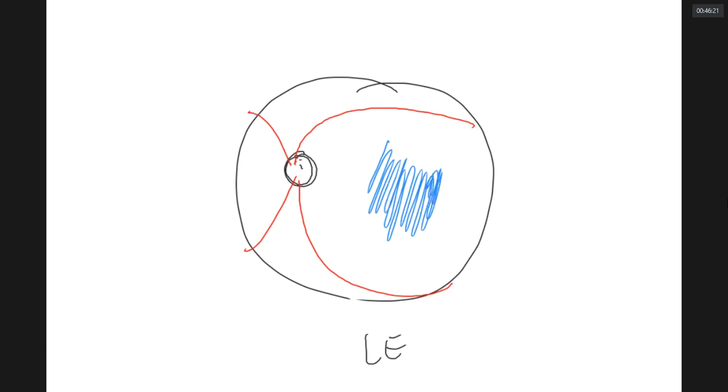Okay, and let's say that this patient has a macular edema. So you shade with a blue color in the macula. And let's say that this patient has a lesion or a scar or any clumpings. Okay, you use black color. Or let's say that this patient has a cotton wool spot. So you use a yellow color for cotton wool spots. Okay. So I think that's it.